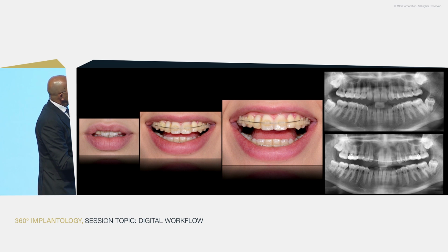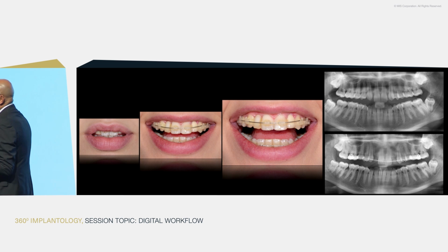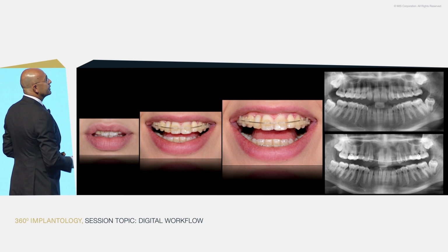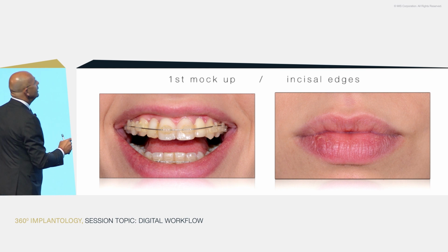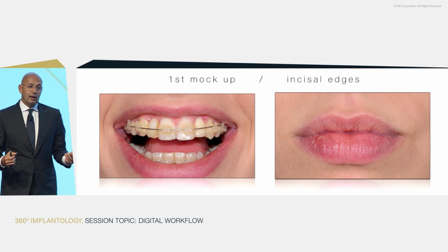So the canines were moved out bodily to open space for the implant placement. And I cannot see any way other than going with the surgical guide here, because it guides you so precisely that you place the implant exactly to where you want, not only mesiodistally, but buccolingually as well. So this is my first mock-up.